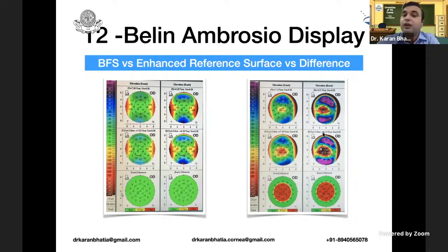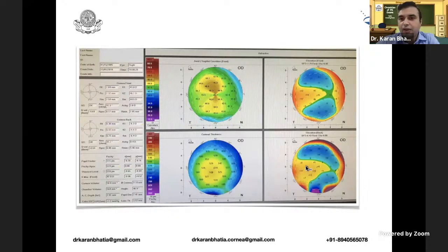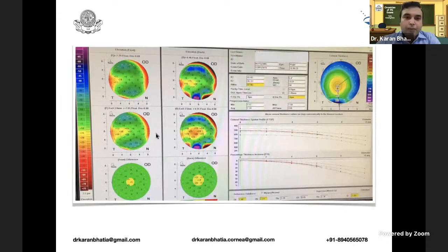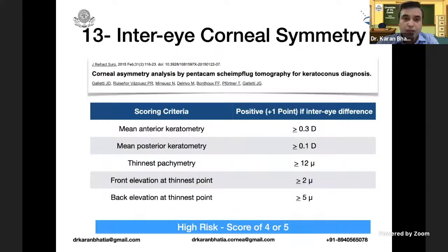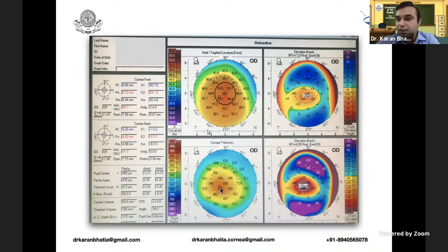Looking at a case: there is an asymmetrical bow tie with superior steepening. Anterior elevation is plus 14, posterior elevation is plus 17 — somewhat suspicious. There is thinning, though not too much. All values are fine apart from the Kmax of 47.9. On the Belin-Ambrosio enhanced ectasia display, there is some posterior elevation. Since keratoconus is a disease that starts from the posterior surface, this is a case of keratoconus. In another example, Kmax is 59.5 with a symmetrical bow tie pattern, elevation on both anterior and posterior surfaces coinciding with the area of thinning — clearly keratoconus.